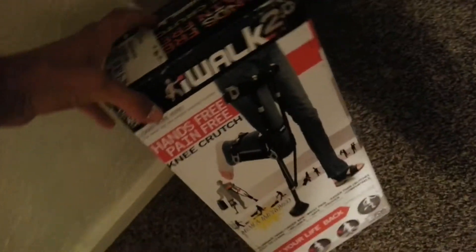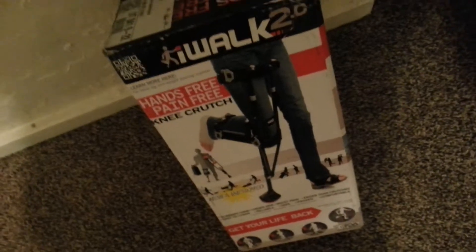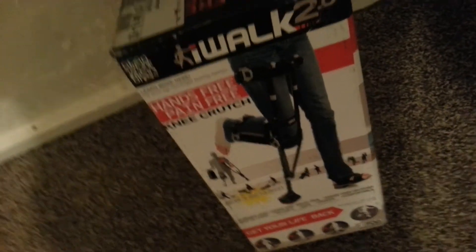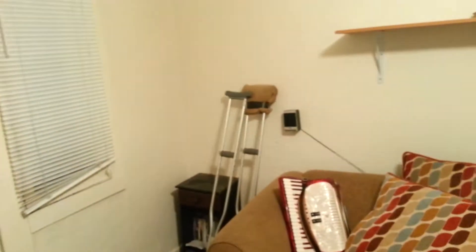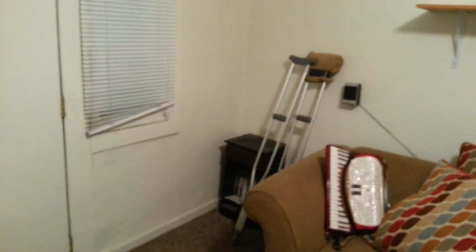Hello Internet. I just wanted to give you a little review of my personal take on this if you break your foot or ankle. This is the iWALK 2.0. The alternative over there are those crutches, and I put a pad on one, and they just suck. They hurt your sides, you can't carry anything.